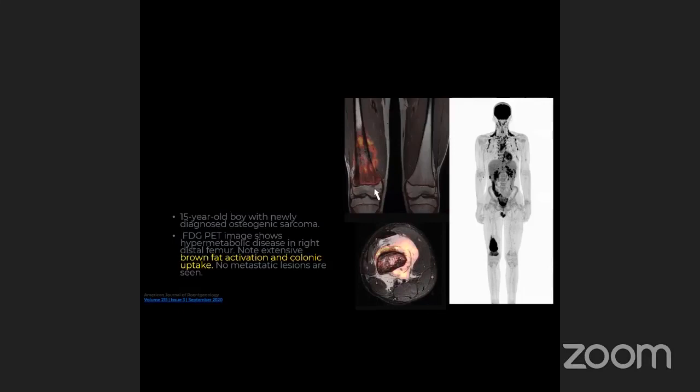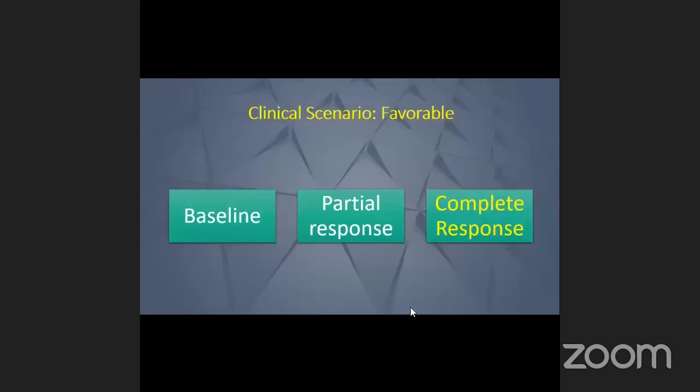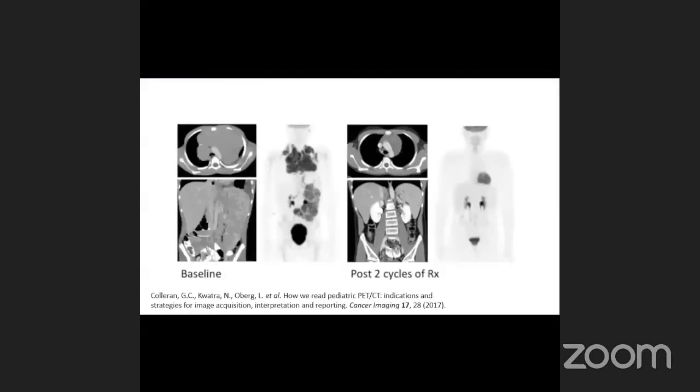Metformin, diabetic patient, metformin, you know about this? Metformin, yes, okay? So sometimes you can have this, there is no metastasis in this case. This is the beauty if you want to know: if you go through these images, you have to know the pitfalls and how you can find what is lesion and what is not lesion.